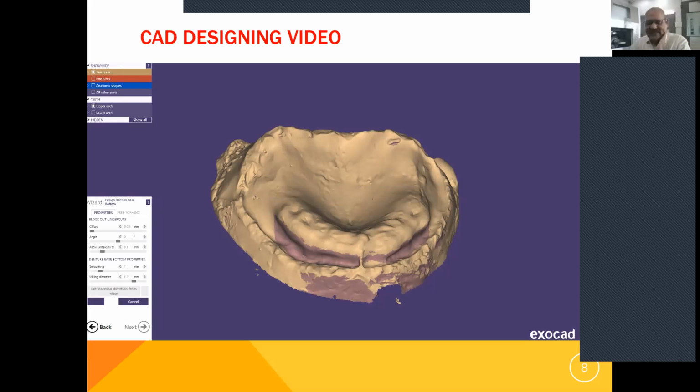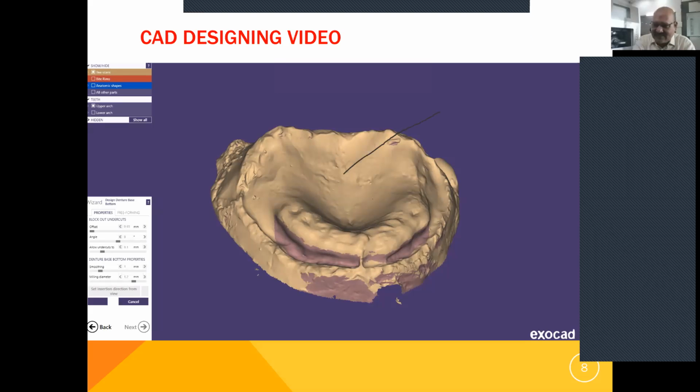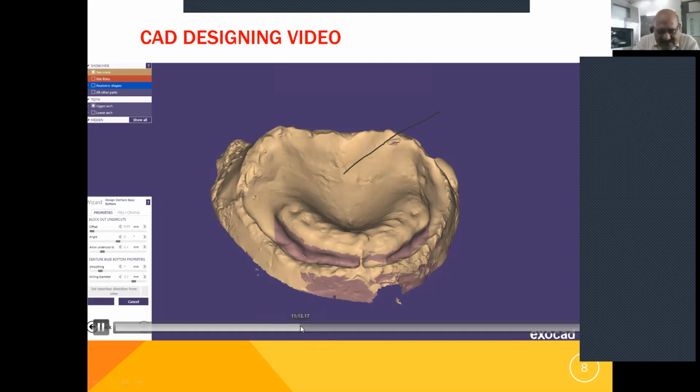Now my whole point is, why digital denture? This makes the retention so accurate and so perfect. It doesn't press the mucosal area anywhere in the patient's mouth, so it doesn't have the hurting feeling, the mild denture. We go a little fast.